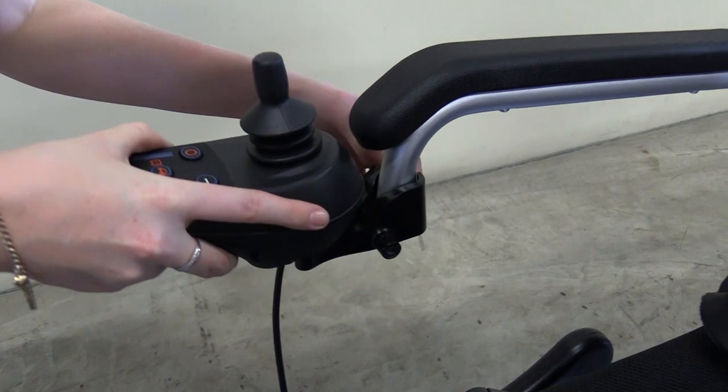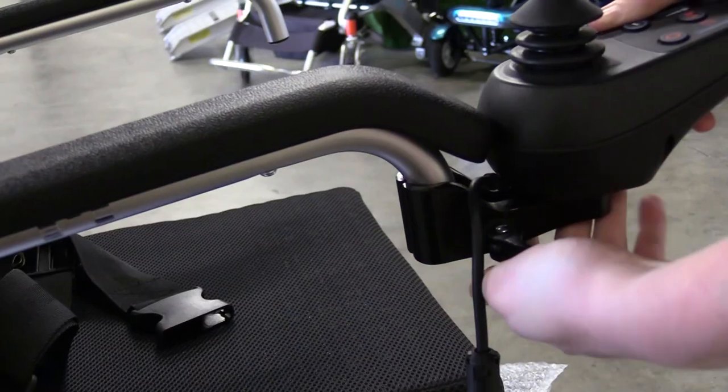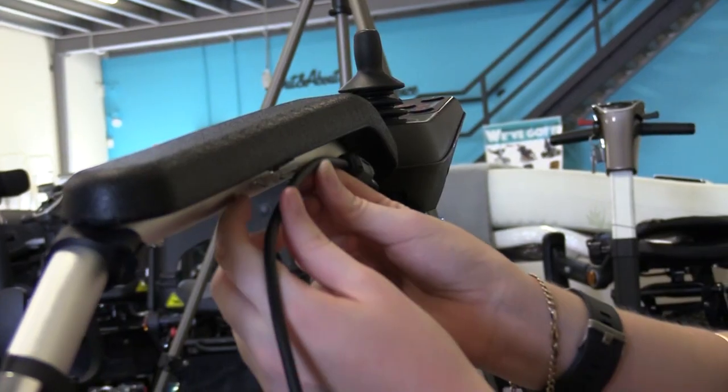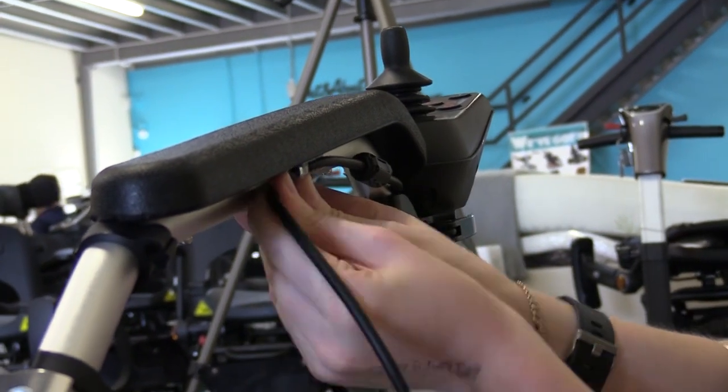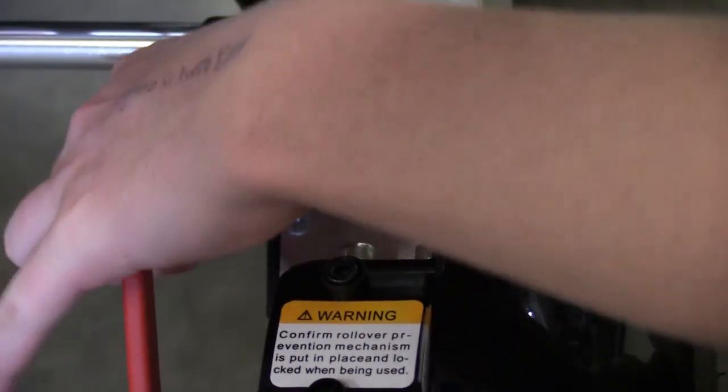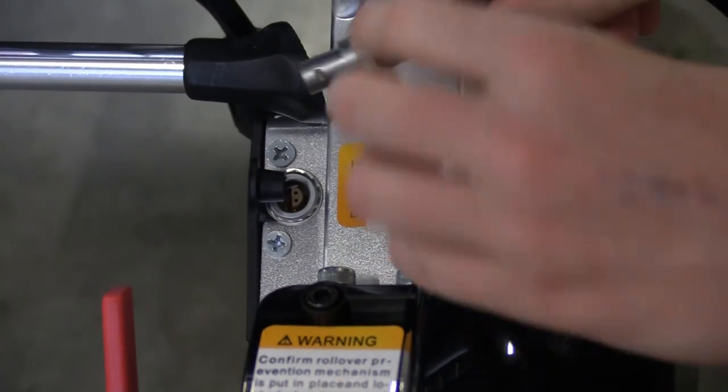Mount the control panel on the armrest and secure it with the clasp. Feed the cable through the clips on the armrest as shown. Locate the control panel port at the back of your wheelchair and plug it in.